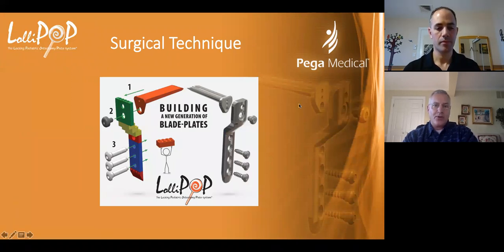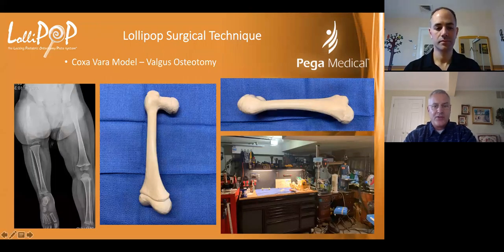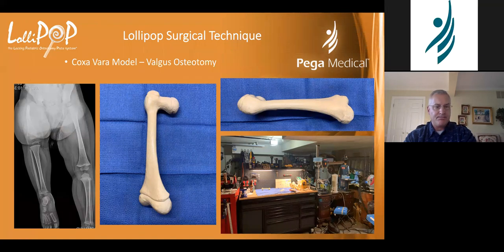So we'll go on with the surgical technique, and this is one of our little play slides that we considered the LolliPOP as little building blocks, and you can really build anything that you want. So this was a little lab that we put together for a couple different meetings. I always laugh, this is my biomechanical lab. This is actually my garage and needs organizing. But this is where I do a lot of my sawbones.